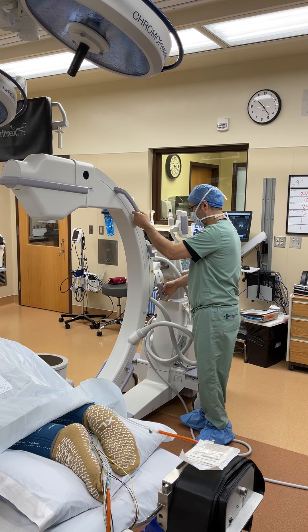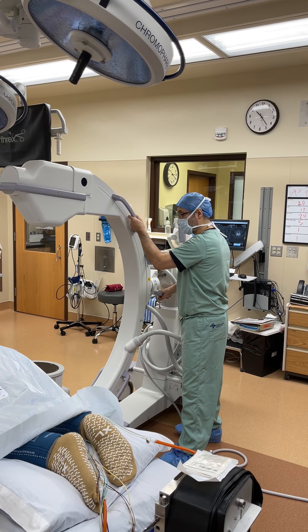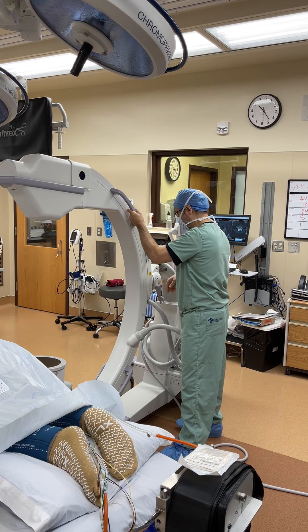I call this arc and tilt. Obviously, this is going to be the one that goes over the patient.